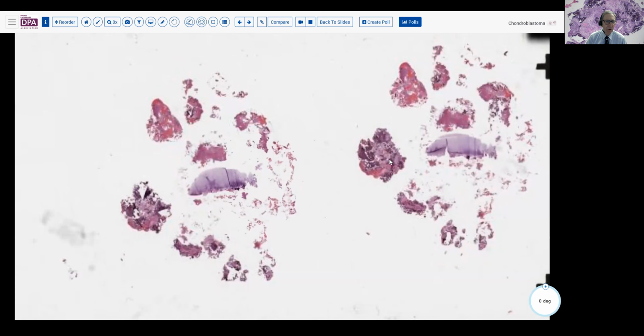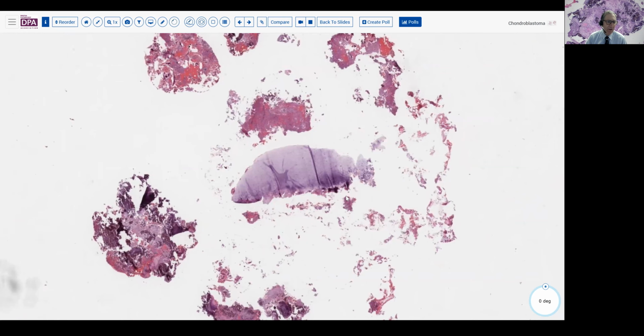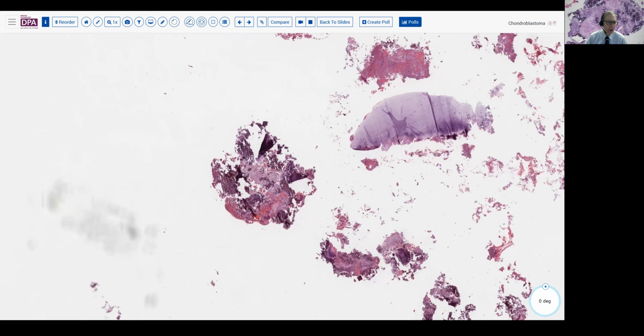And as you can see, we have a couple of chunks of good-sized hyaline cartilage, which of course we might expect given that we saw how this lesion was undermining and immediately abutting the joint space and undermining the articular cartilage. So not surprisingly, a fragment of articular cartilage collapsed into the cavity and was evacuated with surgical evacuation.